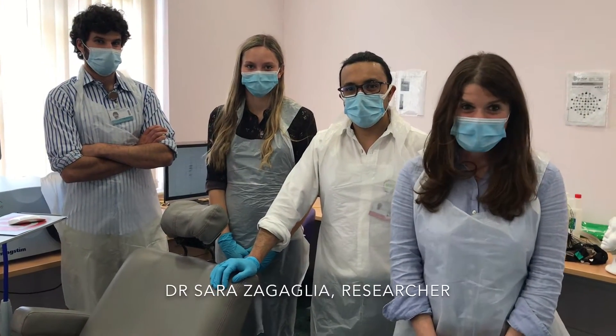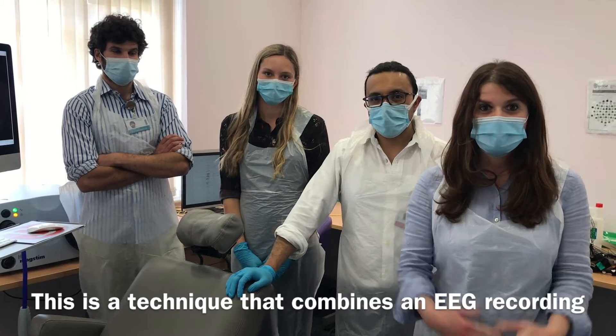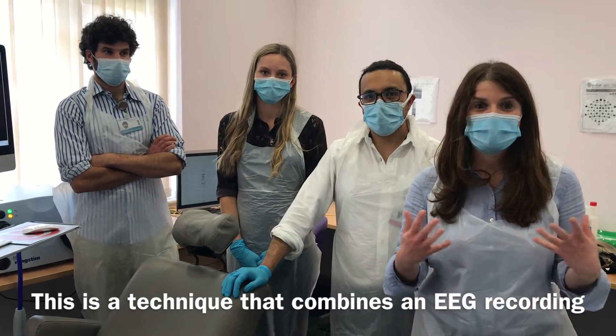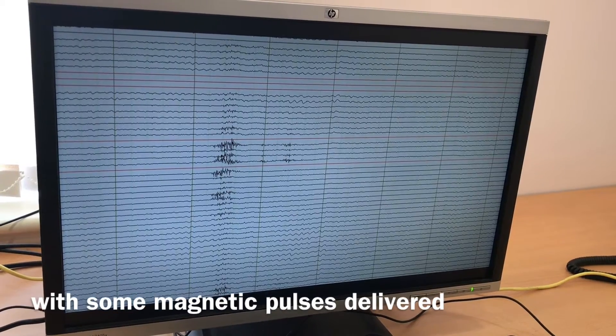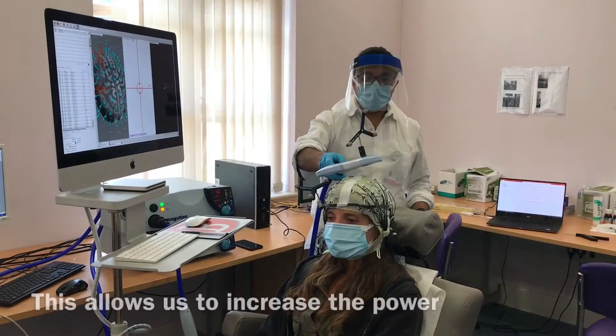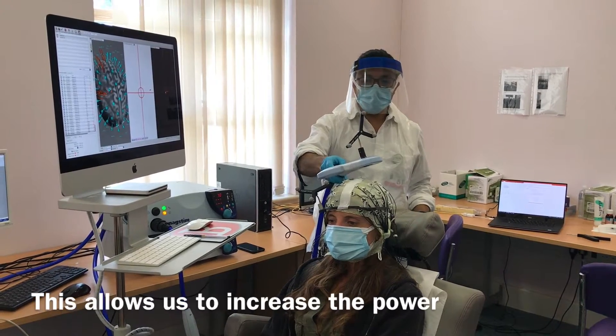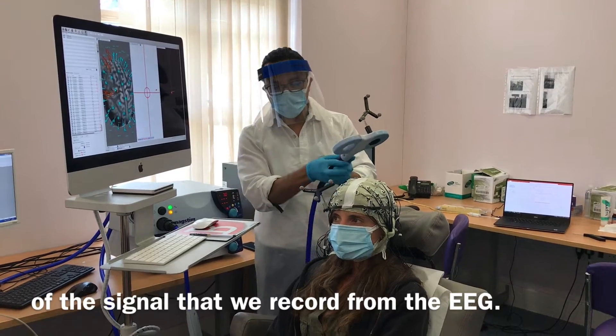I'm Dr. Sara Zagaglia. I am one of the clinical research fellows. This is a technique that combines an EEG recording with some magnetic pulses delivered over the surface of the head. And this allows us to increase the power of the signal that we record from the EEG.